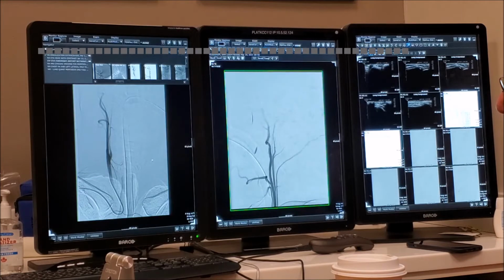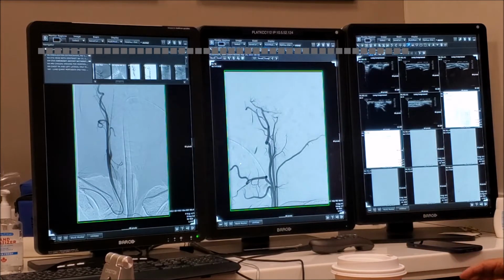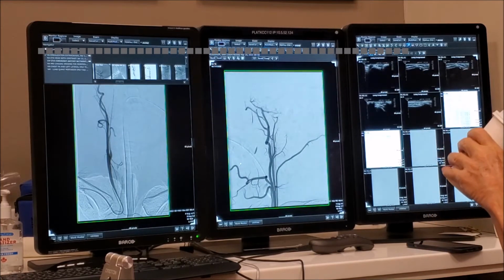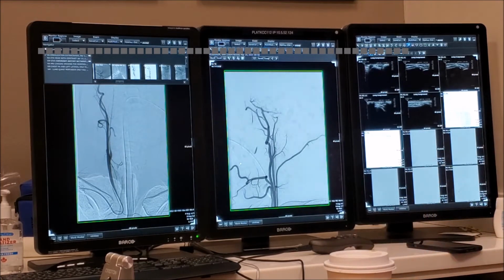Okay, look at that. Fascinating. And also shrunk the canal. So here we have a teeny weeny vessel, right? Okay, and a big vessel. So which one is the internal carotid? Which one is the external carotid? Anatomically, the more posterior one. Physiologically, the more anterior one.